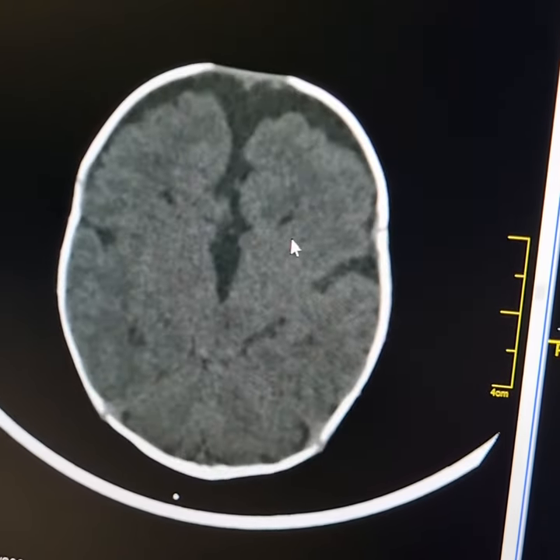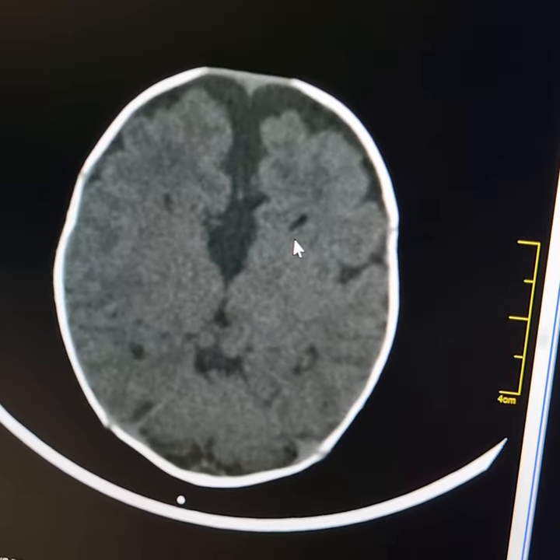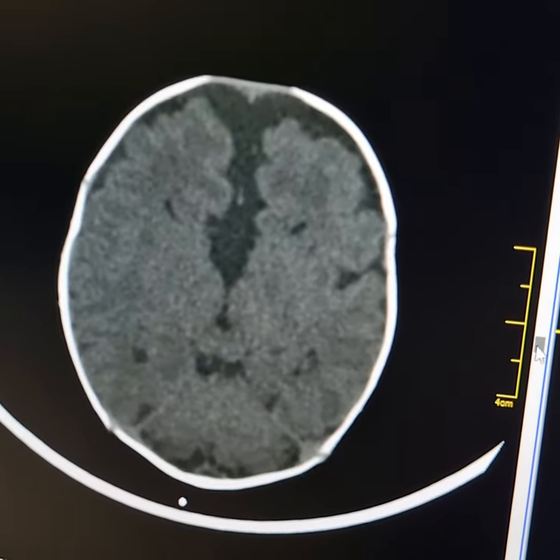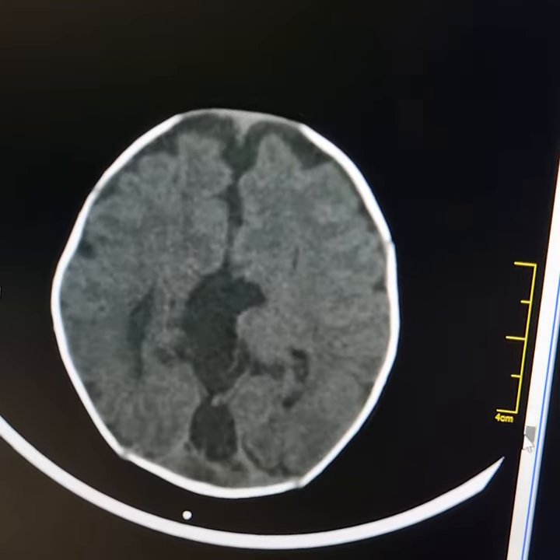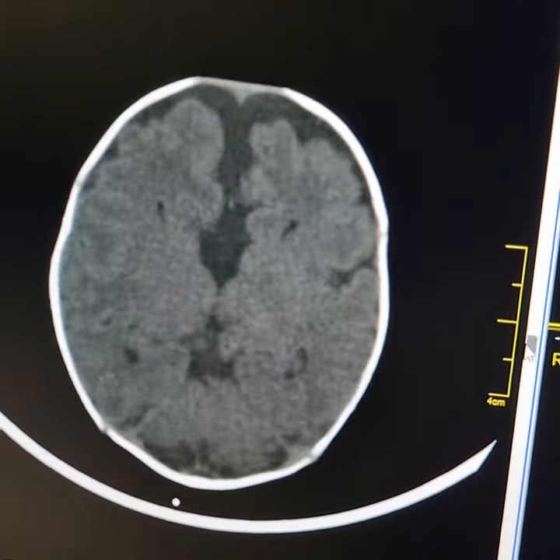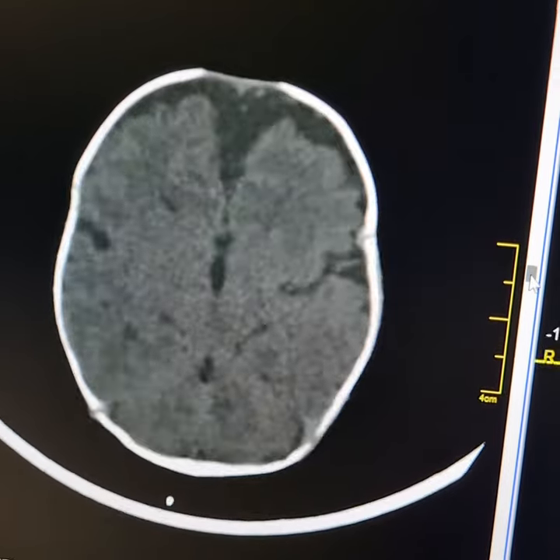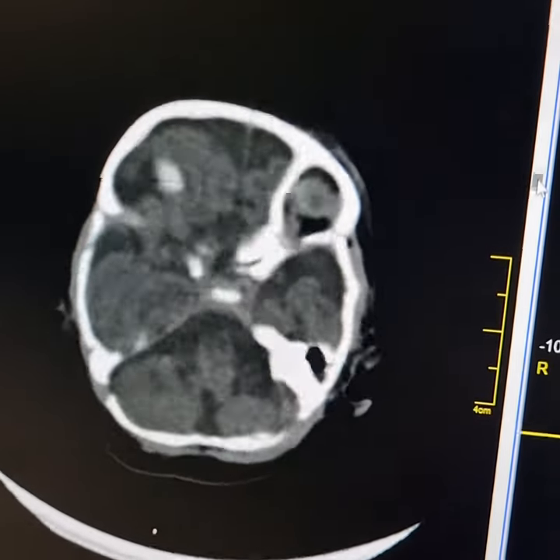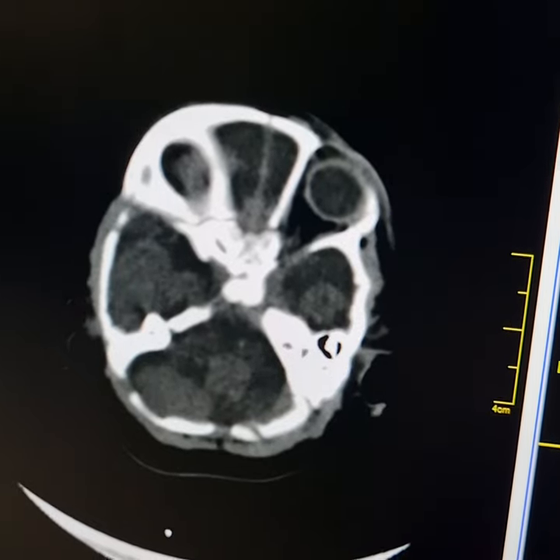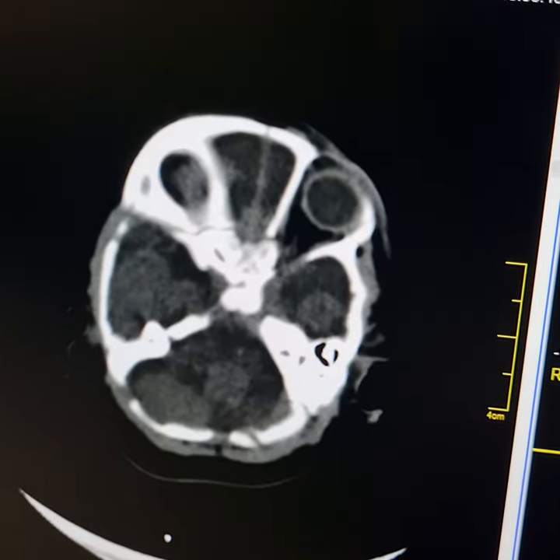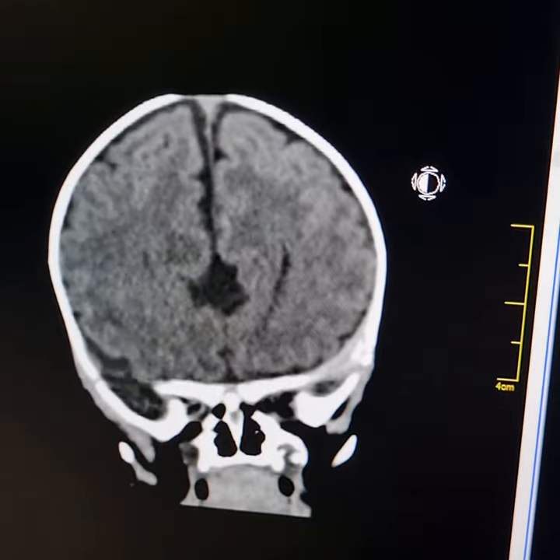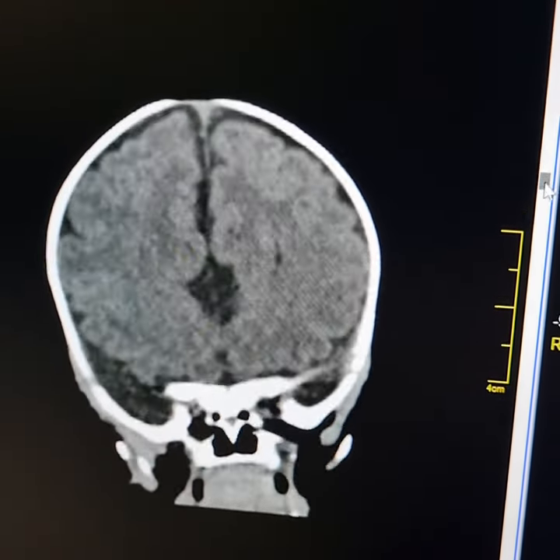Please observe that there is separation of both the cerebral hemispheres. These are slit-like lateral ventricles which are also displaced laterally. This is the corpus callosum agenesis.